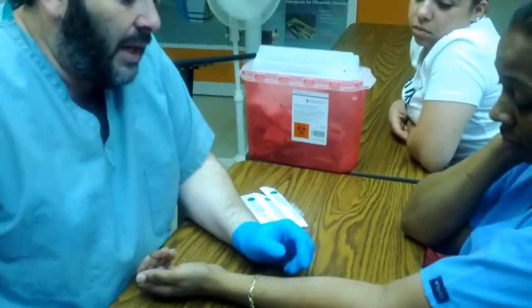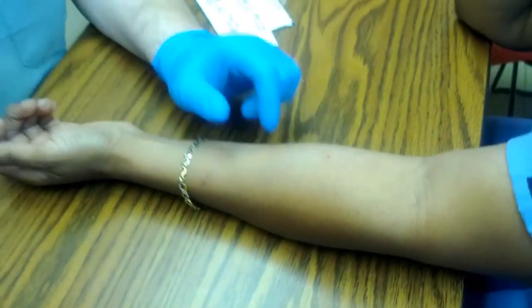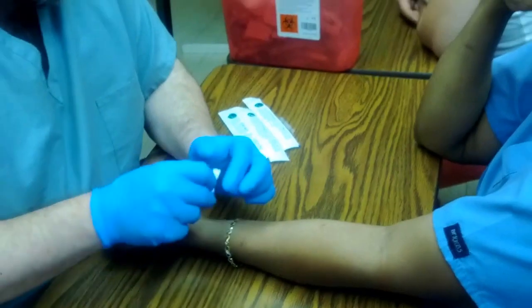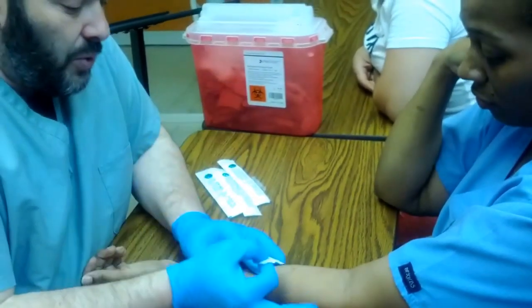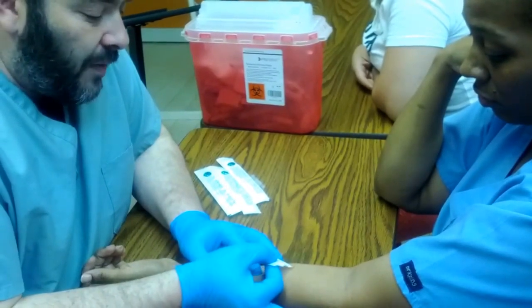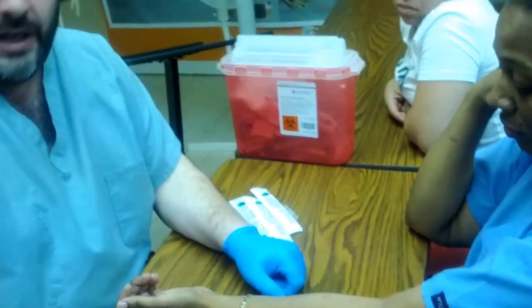We do not apply any gauze or any band-aids over this. We simply issue instructions to the patient. However, if you do have a little bit of blood right over here, sometimes it's a good idea to take your alcohol wipe that you used and just put the corner of it right there, and it's going to, just like this, suck up the blood from there, gently, okay?